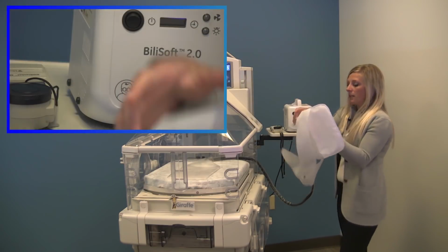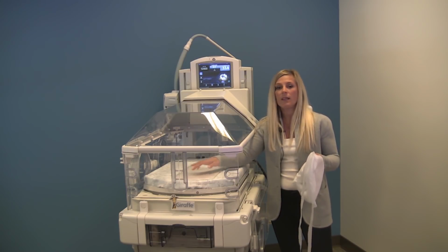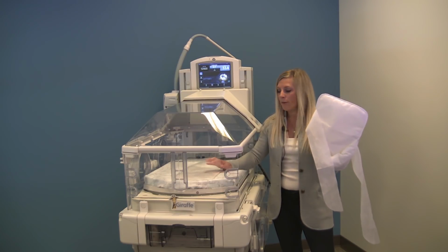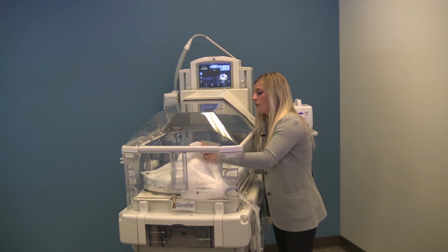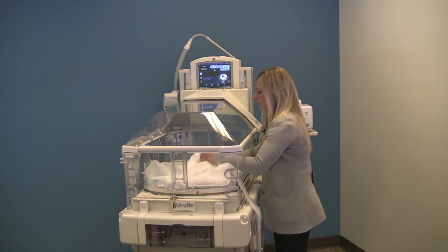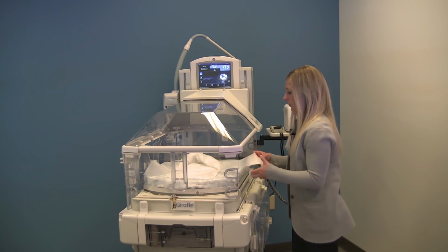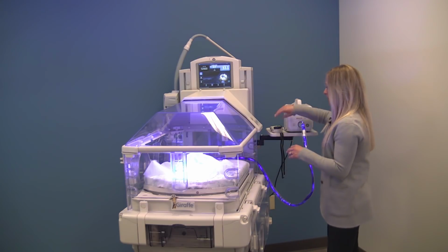While my side is down, and just as a sidebar, we recommend checking the 6 points on the small pad, 9 on the large pad of irradiance prior to putting your pad cover on. So we'll just go ahead for this training and say we've already covered that technical aspect. So I'm just going to put my pad cover on. All right, and again, this is if my baby's head of the bed is up this way, and we'll see that in play. So now I will turn my bank on.